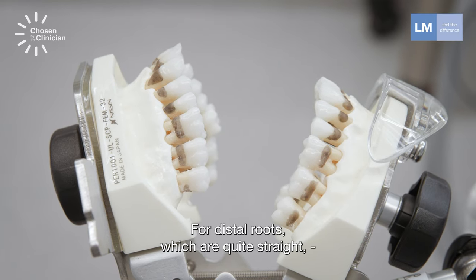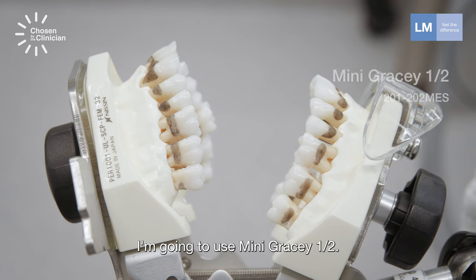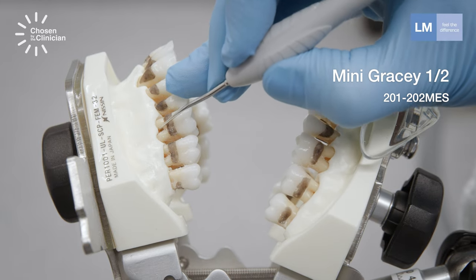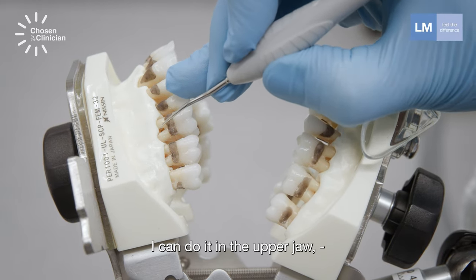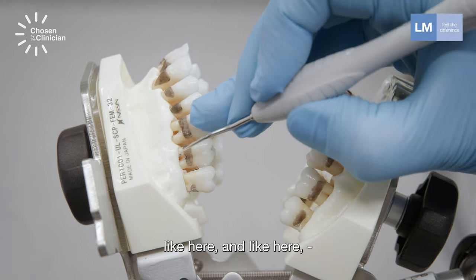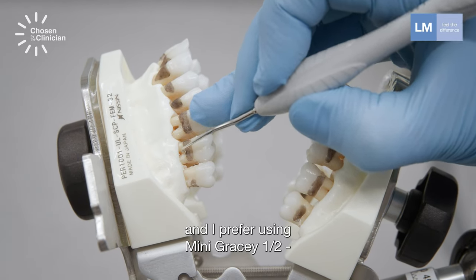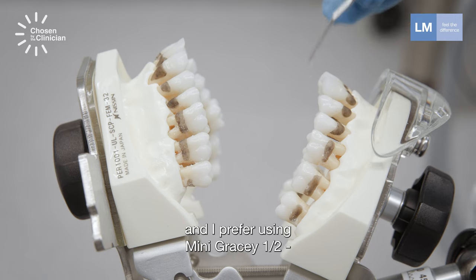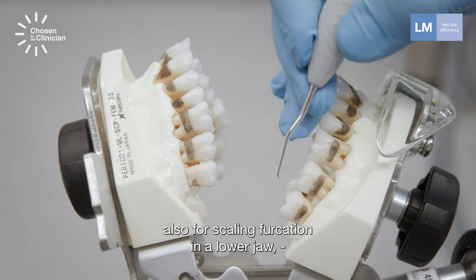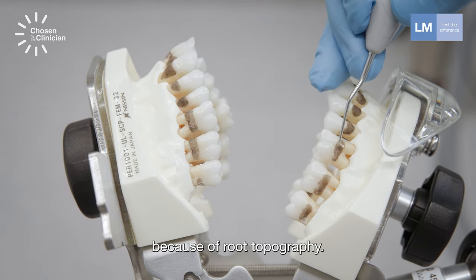For distal roots, which are quite straight, I'm going to use mini Gracey 1 and 2. I can do it in the upper jaw, like here and like here. And I prefer using mini Gracey 1 and 2 also for scaling furcations in the lower jaw because of root topography.